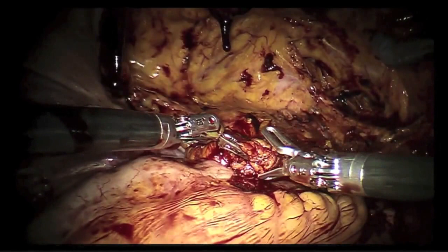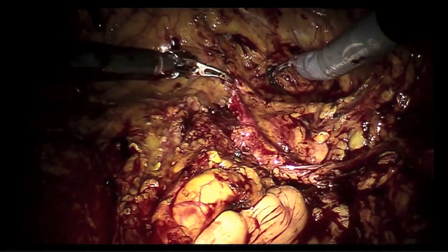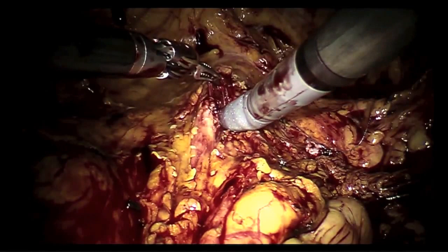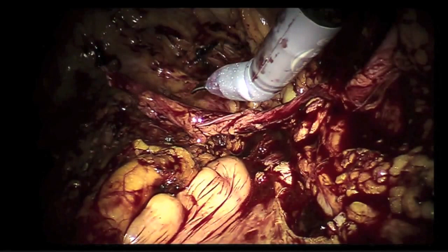Dr. Breda, good job on the harvest. Kidney is looking pink. So thank you. Okay, good. I'm going to spatulate here. Should I shorten this a little bit or no? No, okay. I'm happy to take any questions.